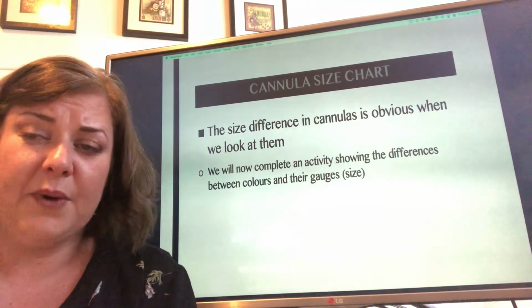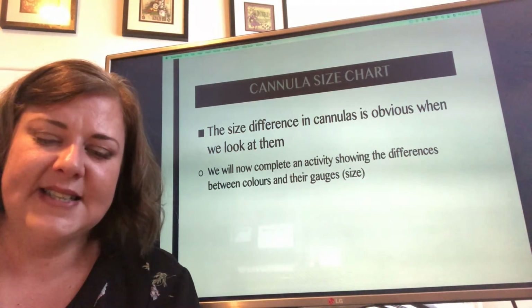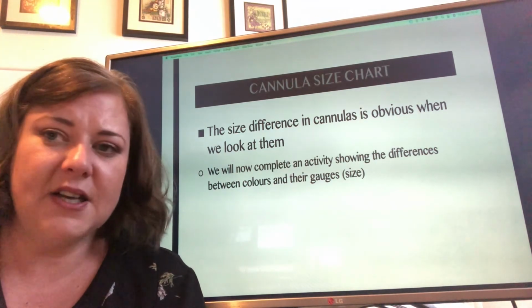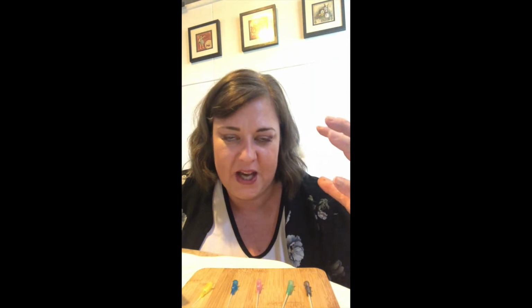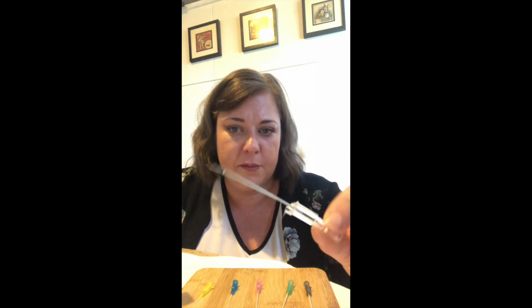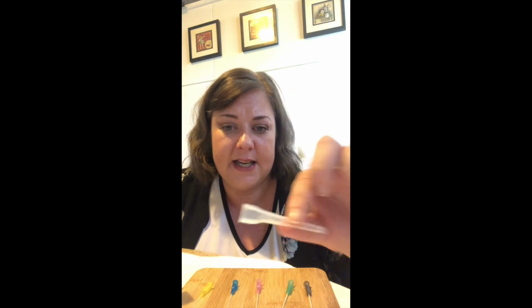We're going to do an activity where we can look at the different sizes of cannulas, and once you start using them, the size difference will be obvious. So this demonstration is just to help you solidify the concepts we've been talking about, thinking about the colour and the gauge and size of the cannulas that we use in our facility. Before I start, I'll let you know that I've removed the needle from the cannulas and the safety cap. So now they're quite safe to touch and manipulate.